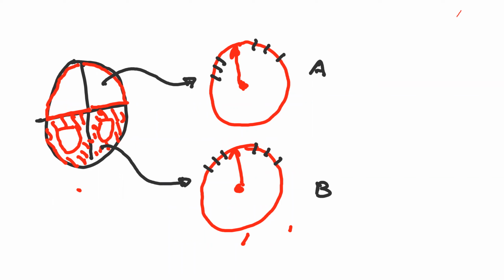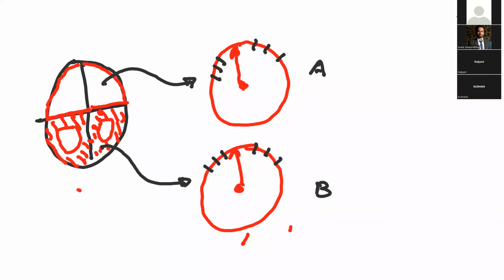Atrial depolarization එක වෙනකොටයි ventricular depolarization එක වෙනකොටයි needle fluctuation එකේ ඔය කියපු concept දෙකට අදාළව, which kind of needle fluctuation can happen when the atrial depolarization and the ventricular depolarization.